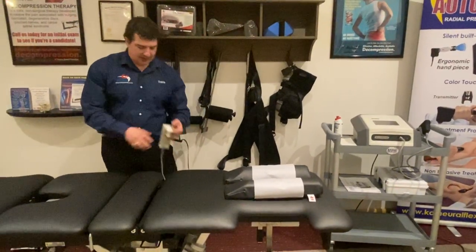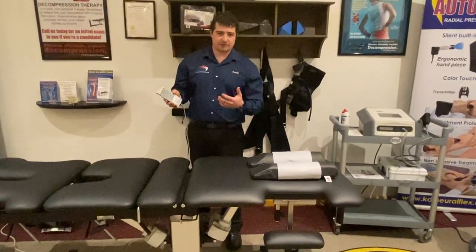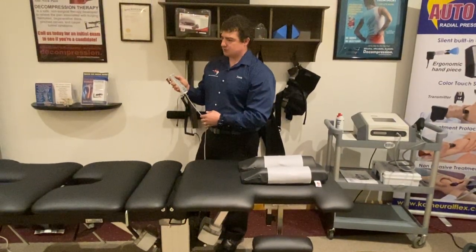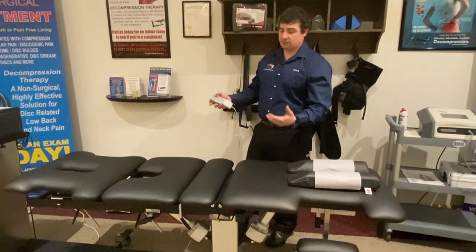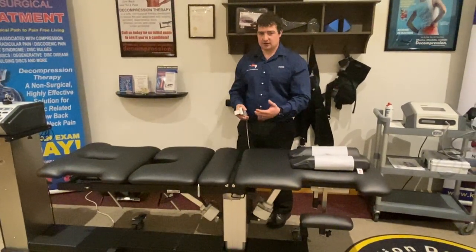There's a hand switch controller here for safety in your office — for children if they're running around. You hook it right on the side of the table to keep it out of the way and concealed. With the hand switch controller, the elevation of the table will go down to 22 inches and all the way up to 37, so it's nice to use even as an adjusting table where you can do side posture techniques.